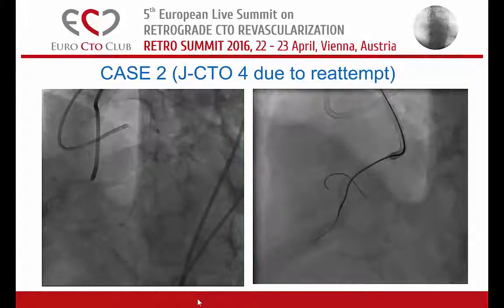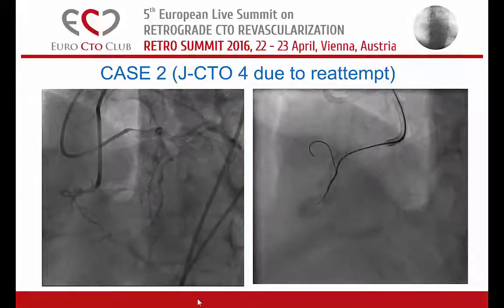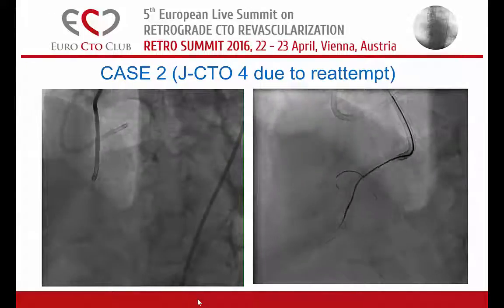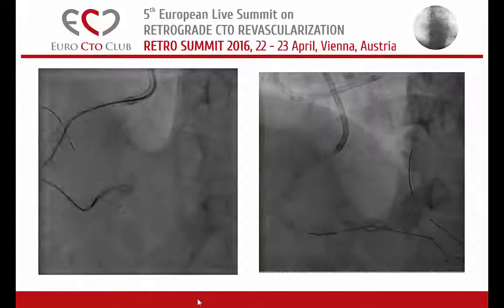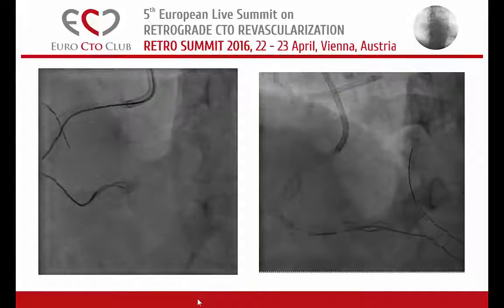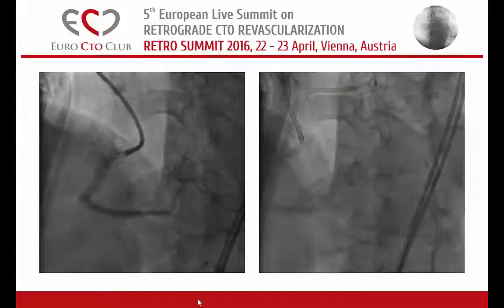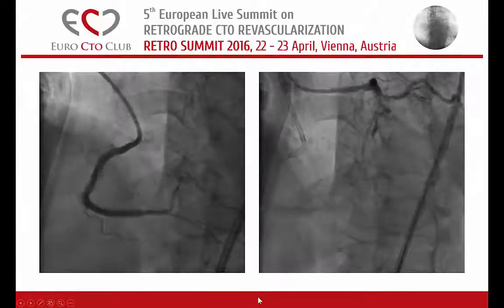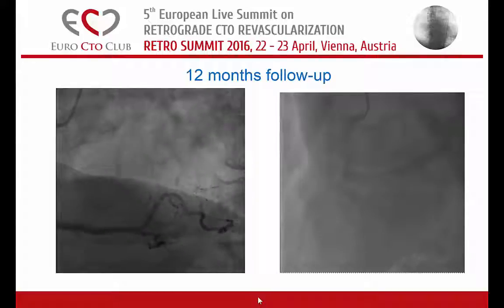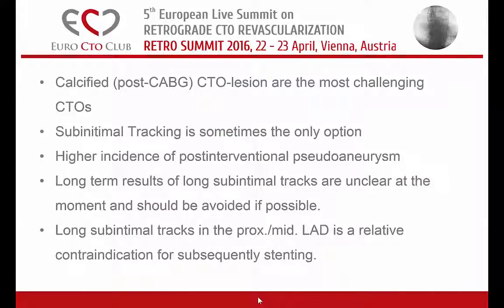The second case also involved going around the calcium because it was so calcified — this time with an antegrade approach. Similar J-CTO score 4 but not an ostial occlusion. I just went down with a polymeric wire after penetration of the cap and knuckled around the calcium, then brought the guide liner down and the retrograde wire down, did an IVUS-controlled retrograde re-entry. This was the result — you see some staining here but no tamponade. At 12-month follow-up it looks really nice, even though we stented along a sub-intimal segment.